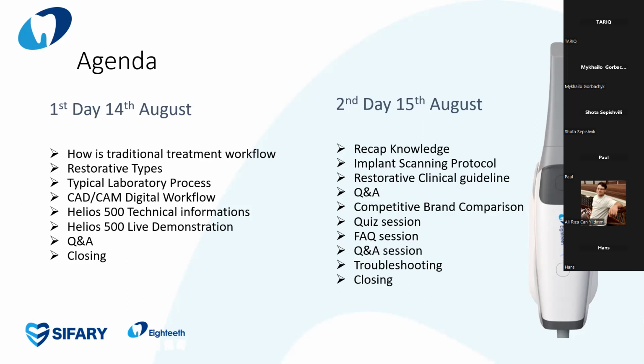Today is easier, maybe for some of you, but tomorrow we are going to focus on the advanced level. For example, the implant scanning protocol, which in the future you will have a lot of questions about. And the restorative clinical guidelines, I'm going to inform you what doctors pay attention to.